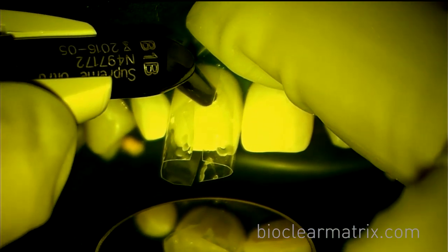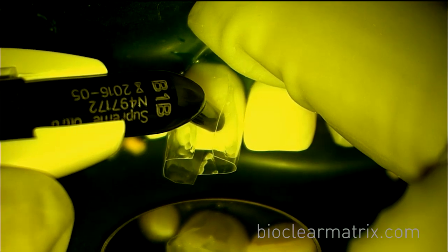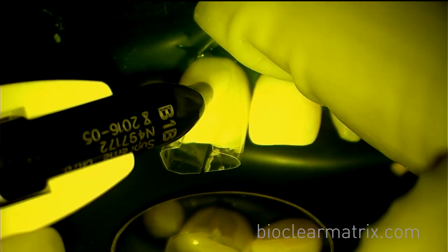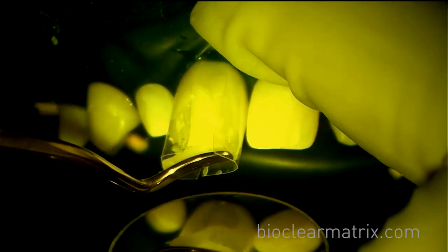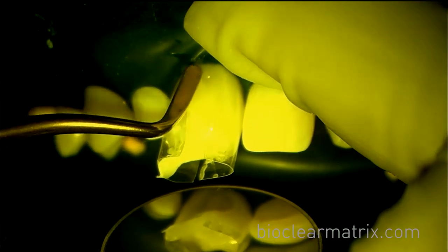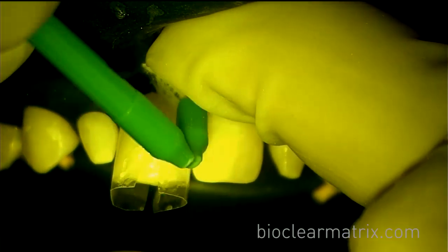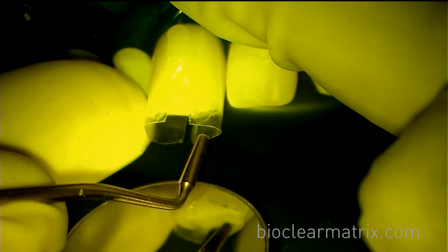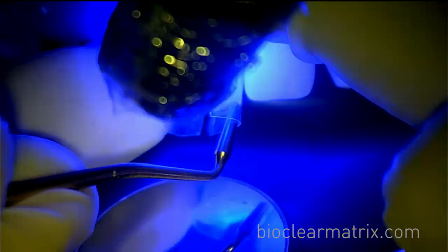Now inject your heated regular composite into the pool of flowable, dispersing the flowable out facially and lingually. To remove any excess flowable, use your brushes until all flowable is removed facially and lingually. Here, Dr. Clark is using an instrument to move the matrix to create a more broad contact area.